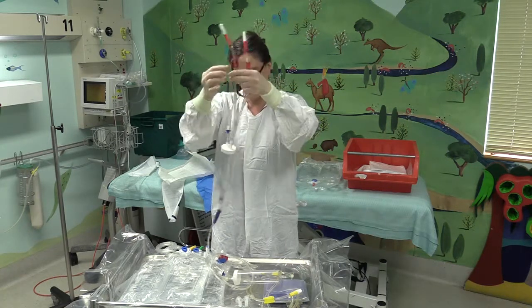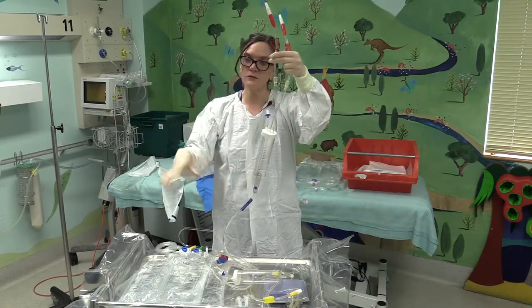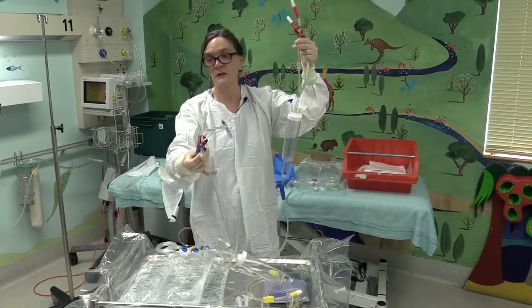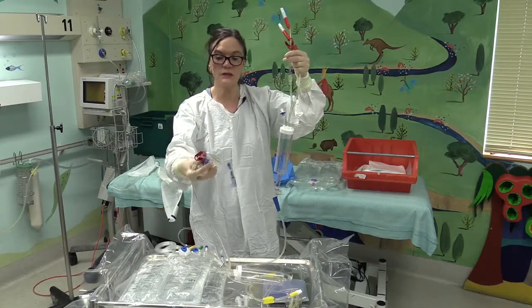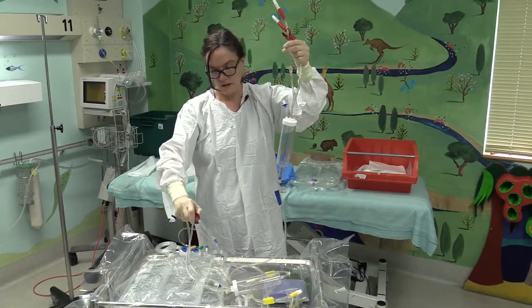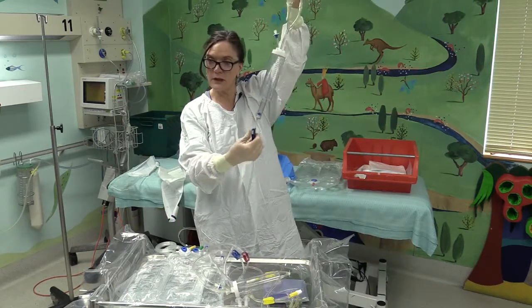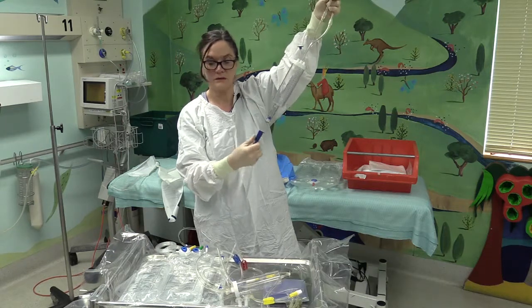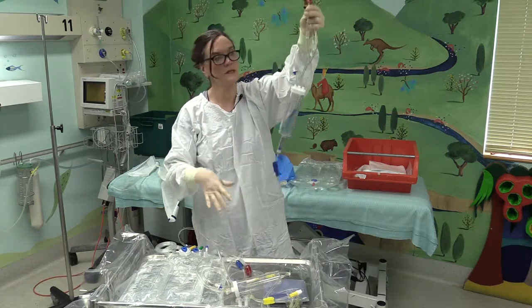So red means filling the patient, and then there's a blue clamp which is the drain clamp. So I'll actually clamp those off for now. And there's a blue roller clamp here, which I'll also roll down till I'm ready to prime the set.